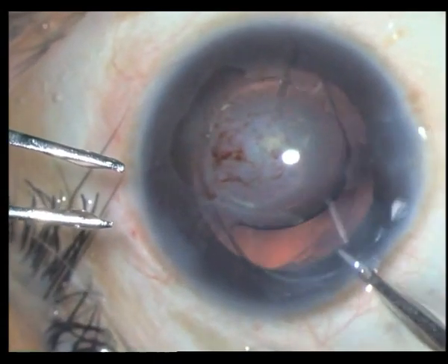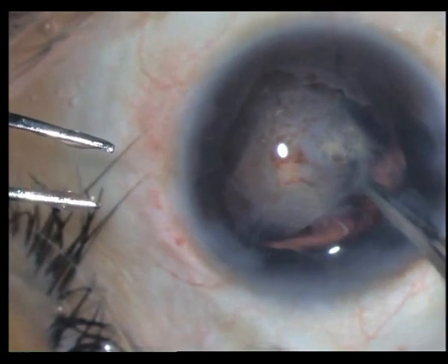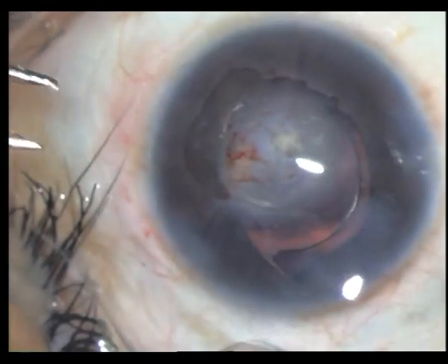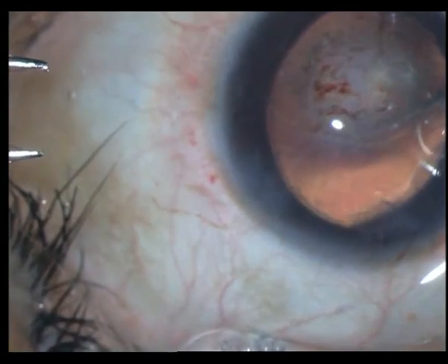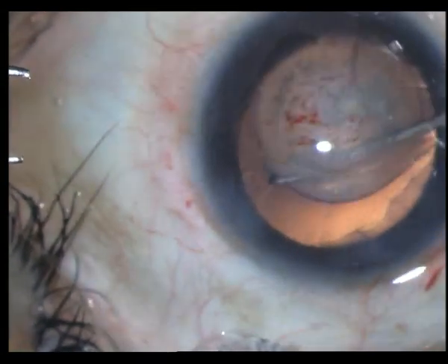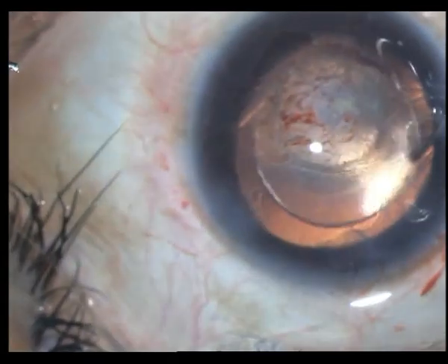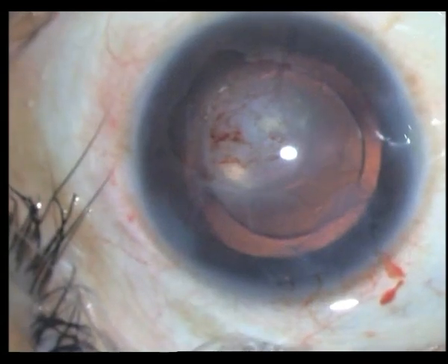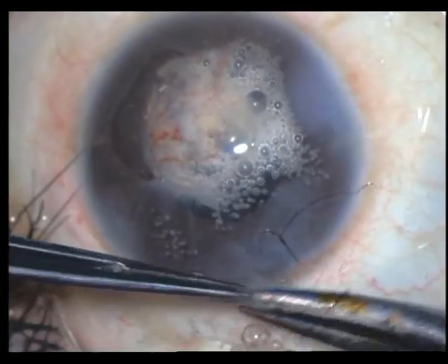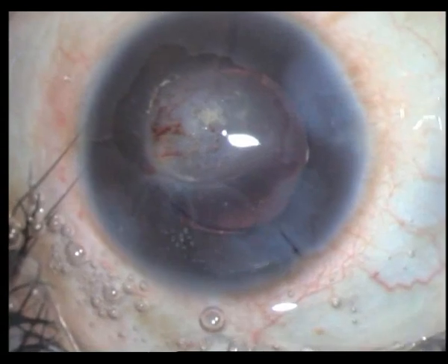Whatever you do, many of these lenses tend to come out in the sulcus anyway. Just putting in my trailing haptic with the aid of a Sinski hook — make sure it's very well horizontally oriented. After injecting my intracameral antibiotic and hydrating the wounds, I just put one suture across.